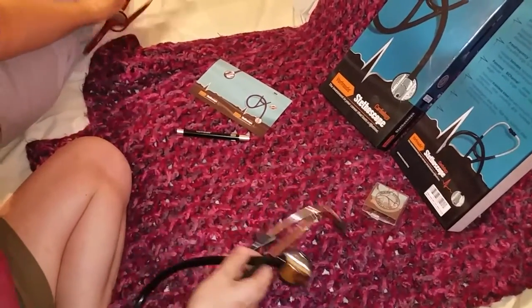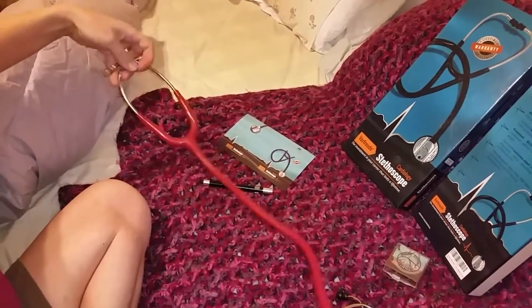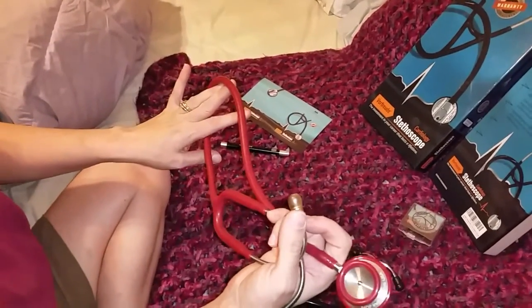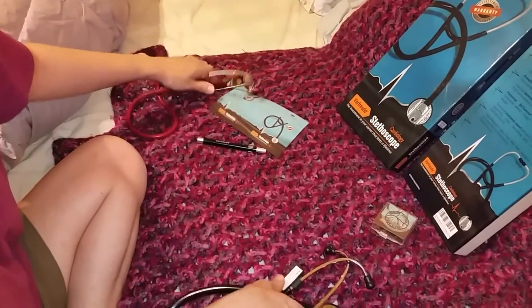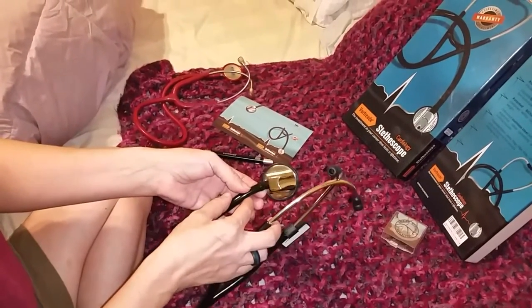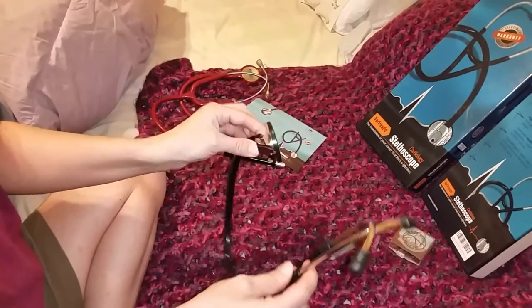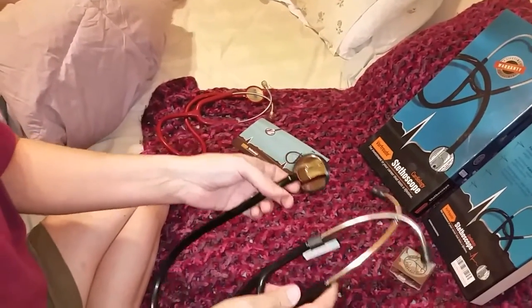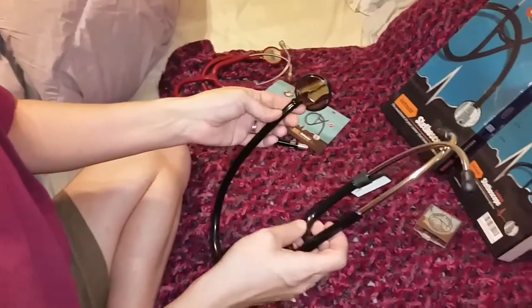This is my older, my original stethoscope. When I used to work in inpatient, this is the one I used, and I was pretty astounded at the difference. I worked in inpatient acute care rehab and hadn't used a cardiology stethoscope before — the difference was just amazing.